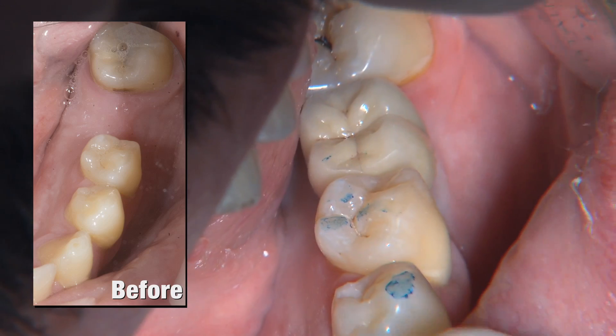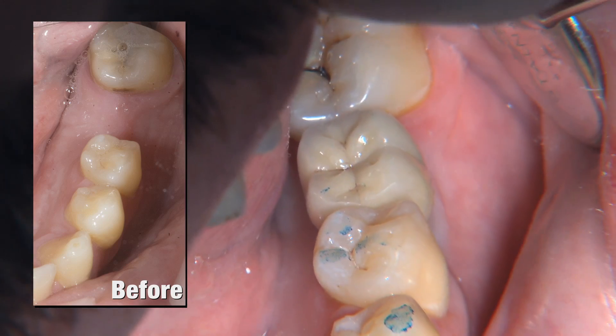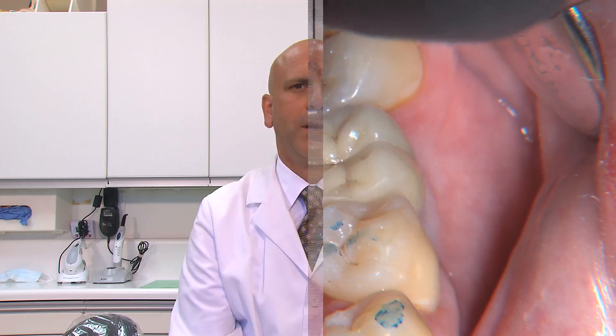Using the high technology available in dentistry today, including the surgical guide, made it easy to get a great result on my first implant. In reality, the average crown preparation is more difficult than what you just saw — and that's because the high-tech solutions allowed a surgical guide precise enough so the drills and implant ended up in the right position. If you've been afraid to surgically place an implant for the last 10 or 15 years, take another look at this digital treatment planning — you may find out you're more ready than you think.